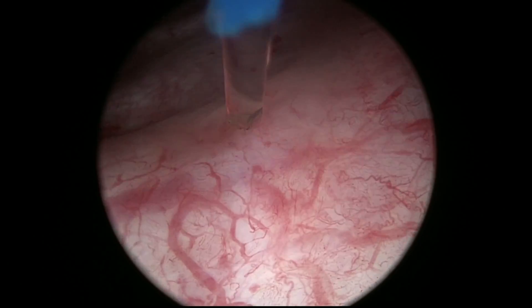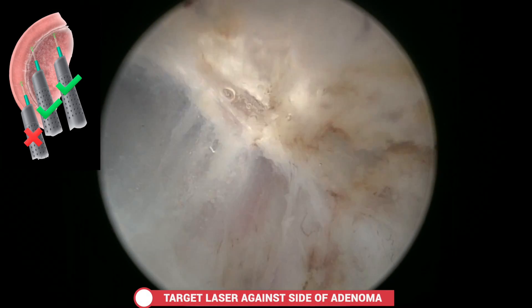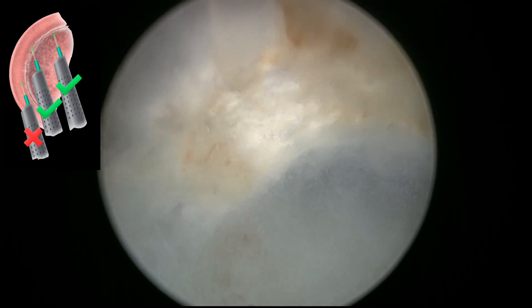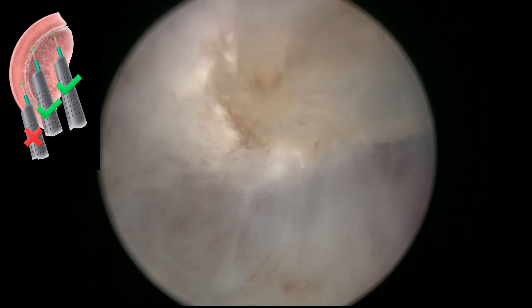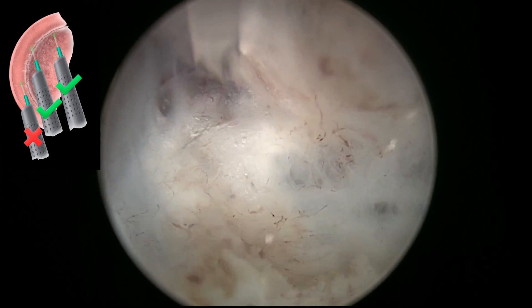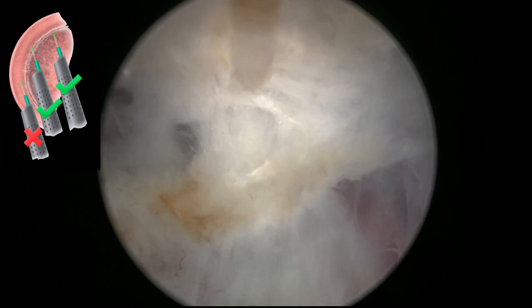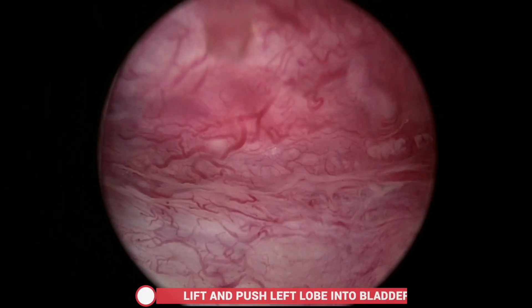We check the position of the uretero orifice, which is far away in this case. It is very important when dissecting difficult angles — for example below the adenoma — to fire closer to the adenoma than to the capsule. This protects the capsule; the energy is absorbed by the adenoma but allows cutting the fibres that join adenoma and capsule.